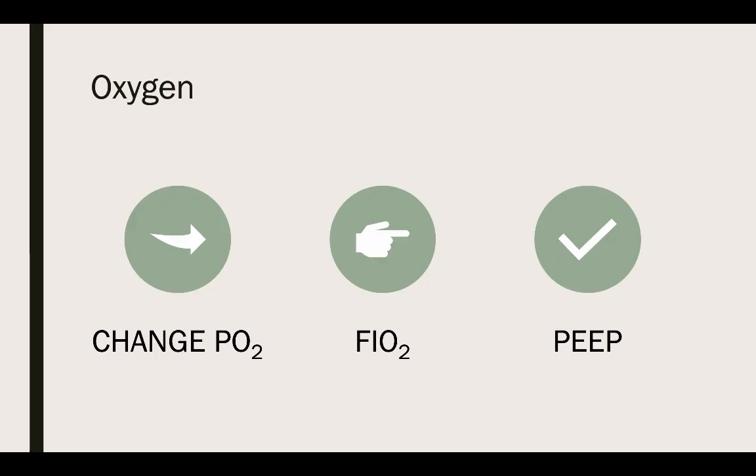Or maybe we're taking off with a patient, transporting a patient now. We've got the last set of ABGs, and we want to fix and change our ABG values. So in this first case, we've got an issue with oxygen. I want to change my PO2. Let's say we've just got them on SpO2. I want to change my patient's oxygen status.